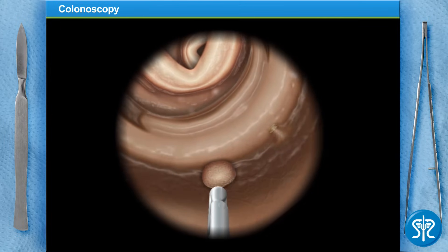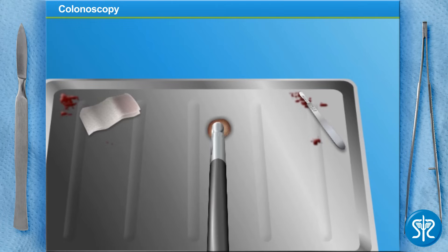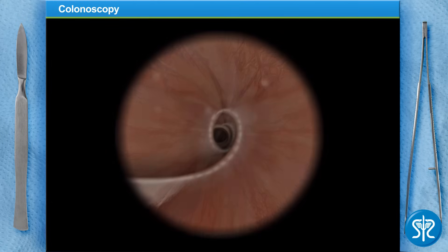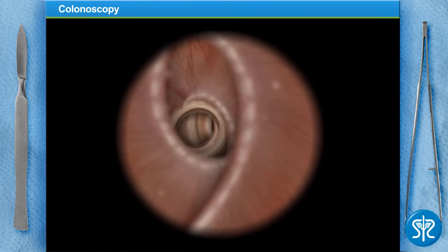Let's slowly withdraw our scope and get that polyp out. Now let's go back in to check the rest of her colon. Remember the name of the colon where we found the polyp? That's right — the transverse colon.